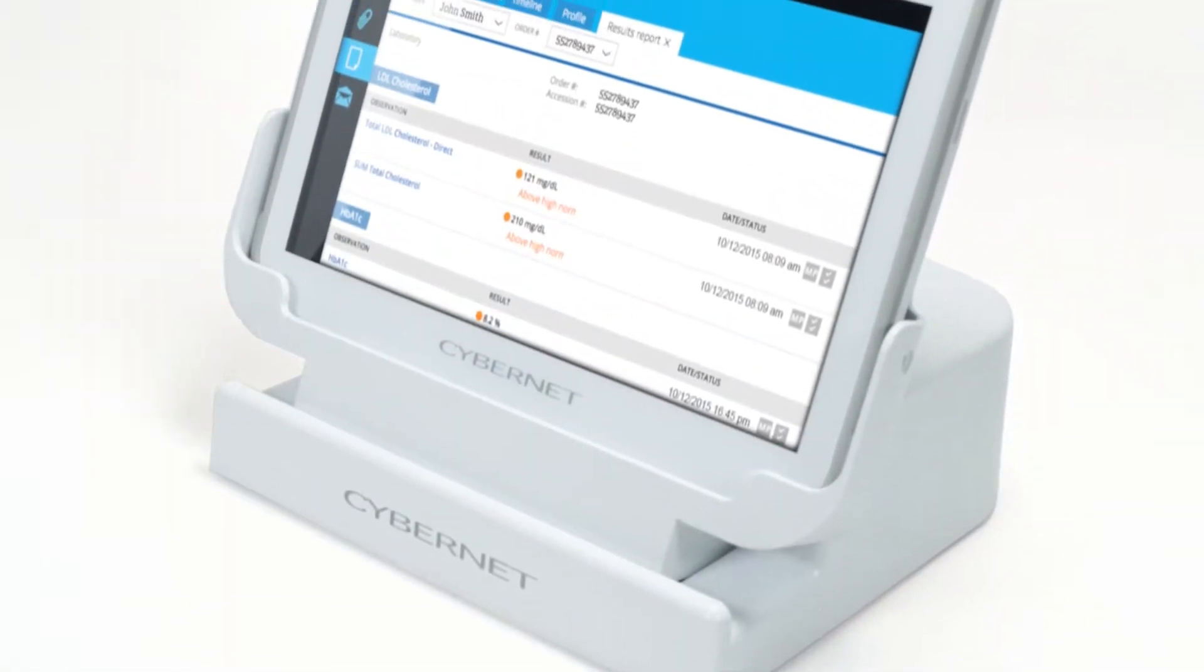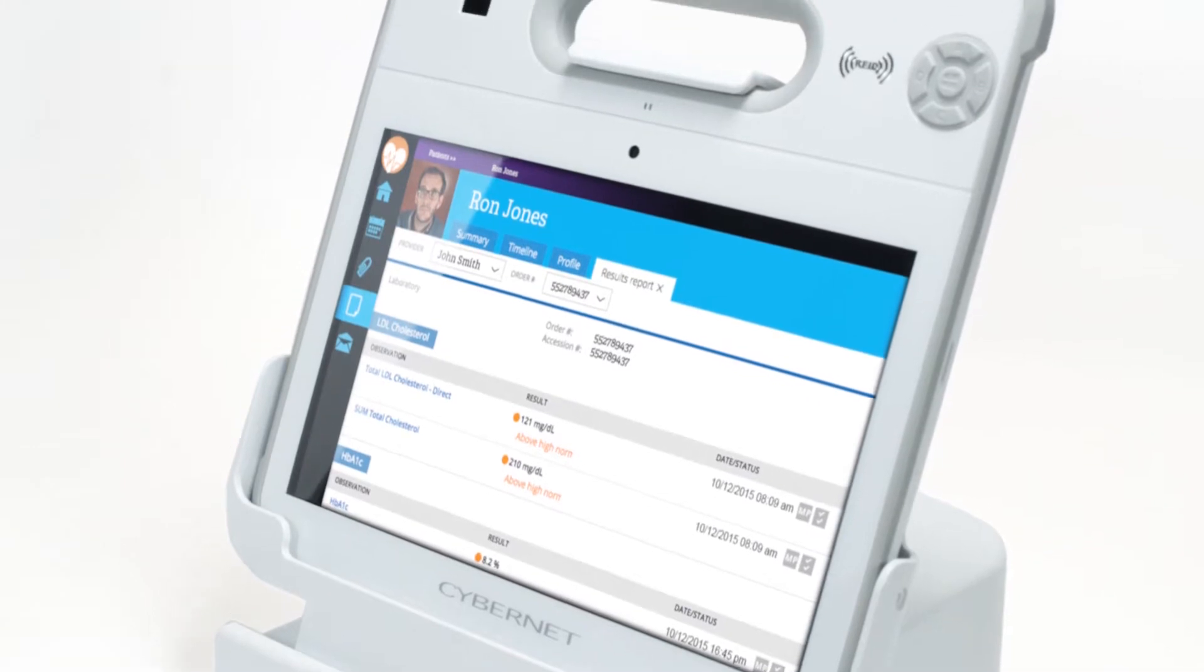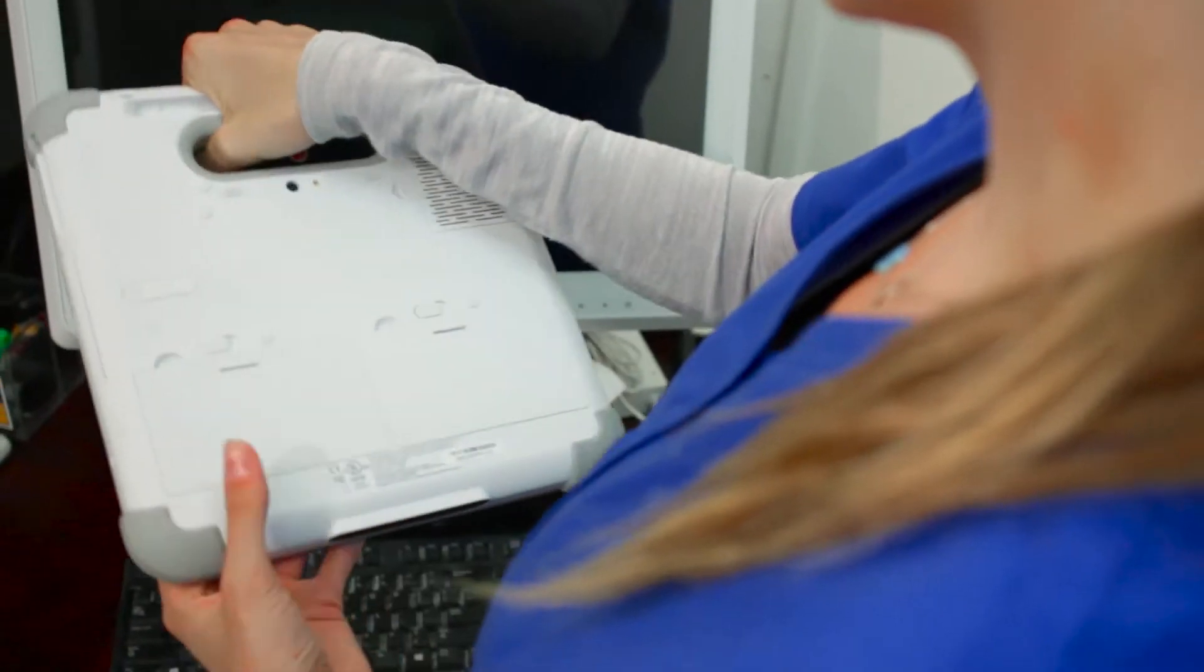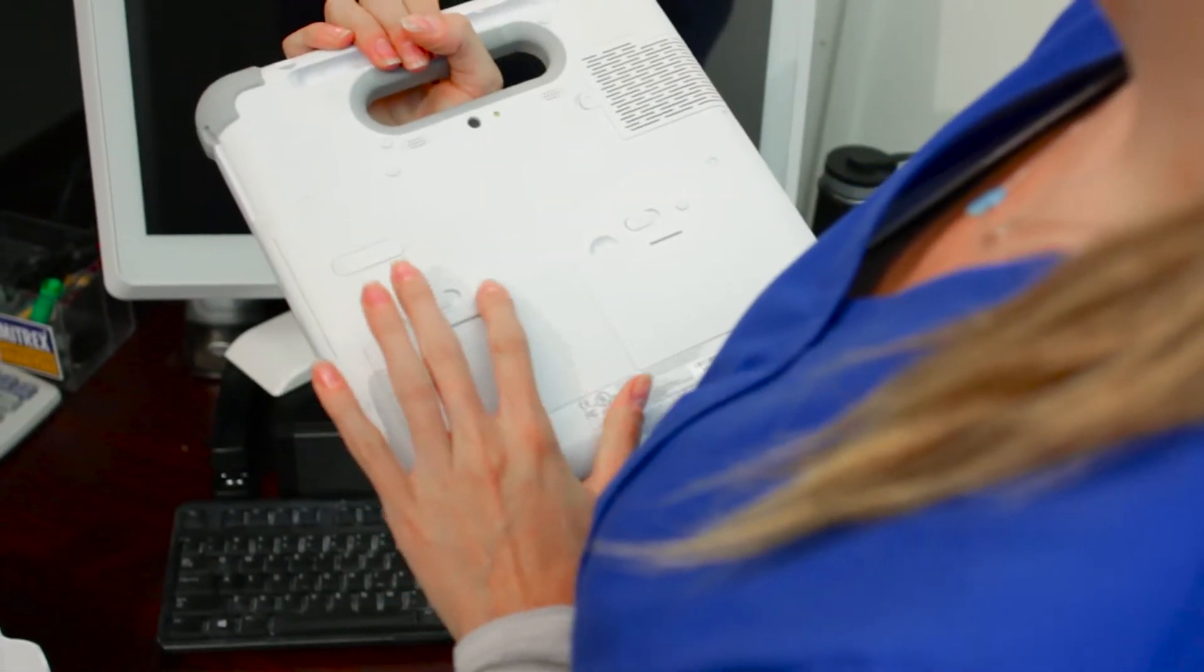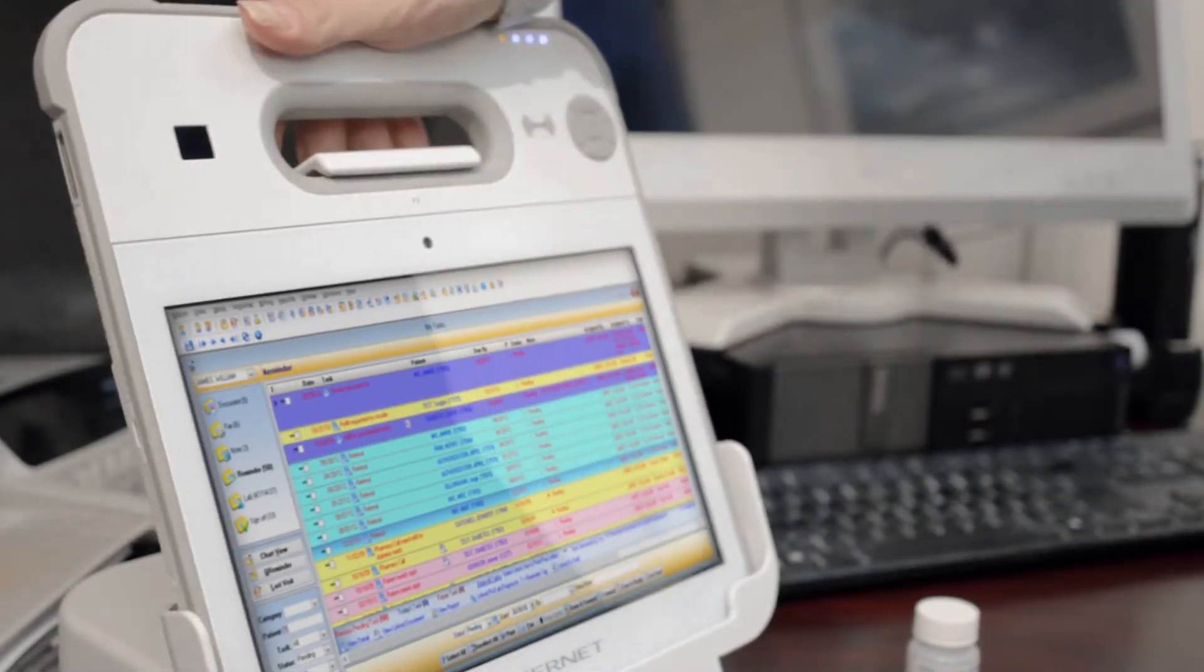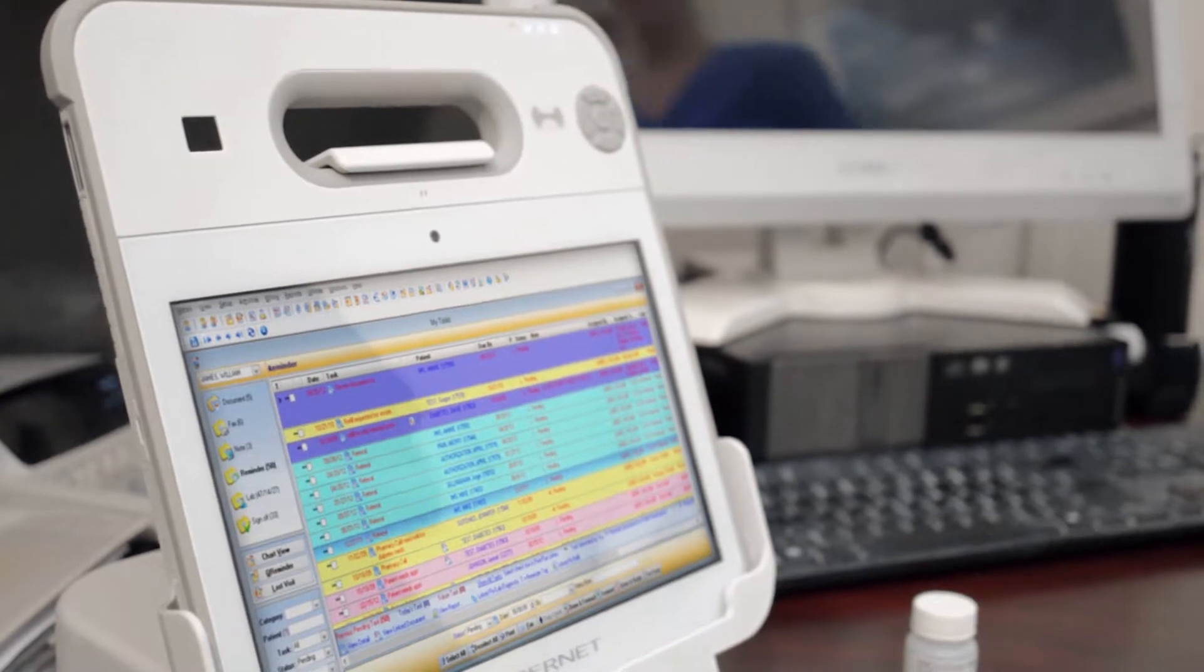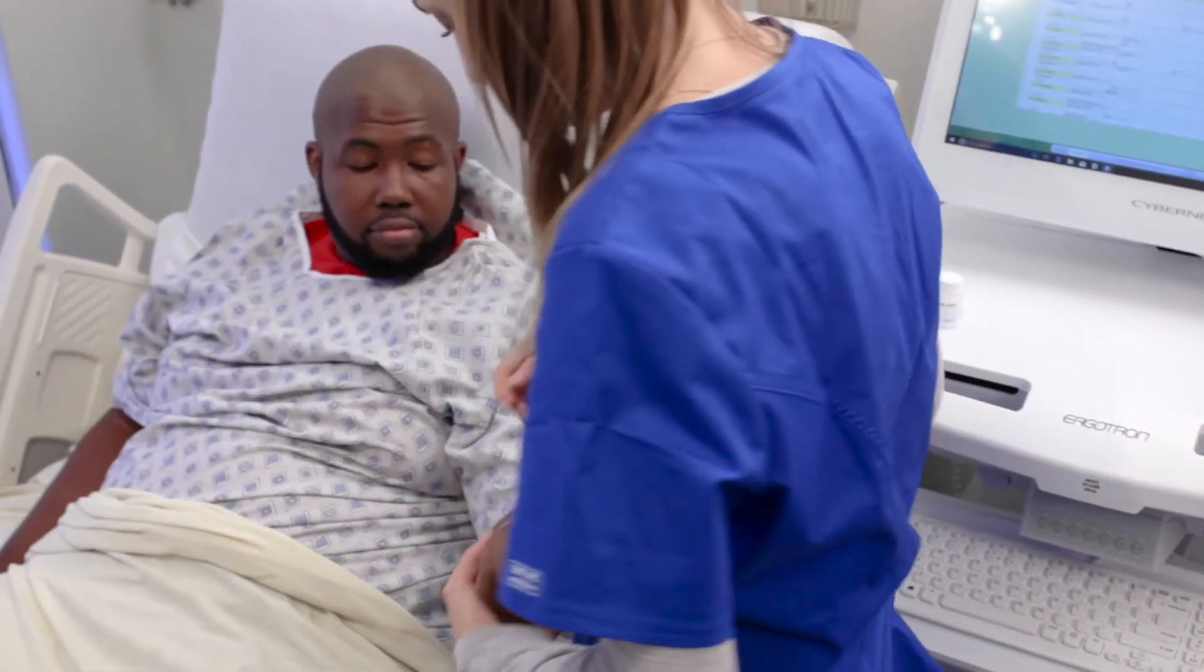It comes equipped with a lightning-fast Broadwell i7 processor. With its two hot-swappable batteries, you can keep the RX running constantly, or you can use the convenient docking station for charging. It features a durable antimicrobial casing that both prevents the spread of germs and is able to withstand drops from short distances.